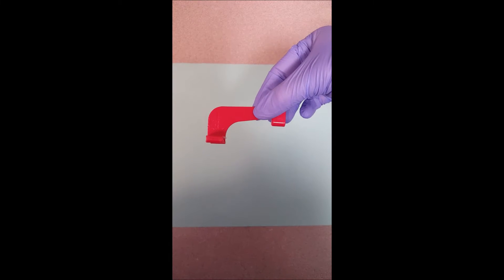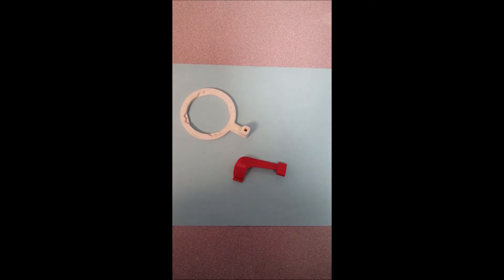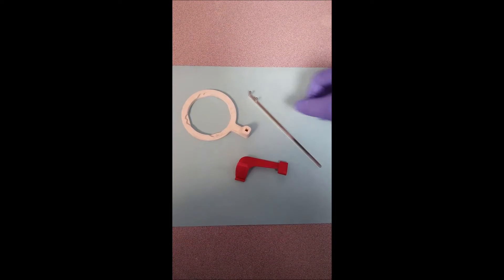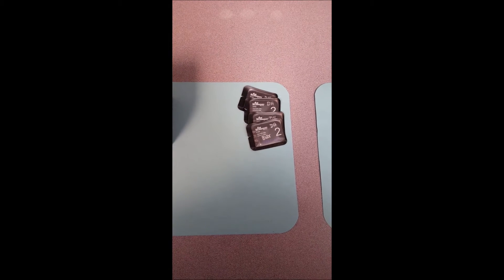The proper materials needed are the x-ray film holder, XCP instruments and rods for size 2 phosphor plates, and a film box.